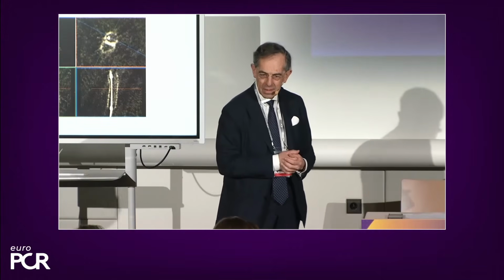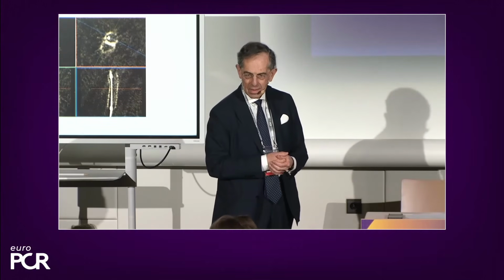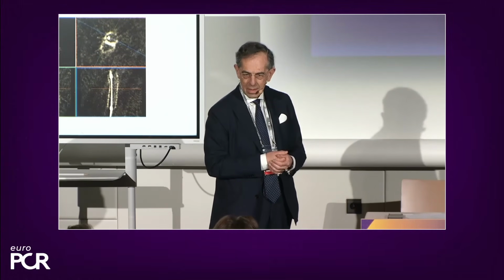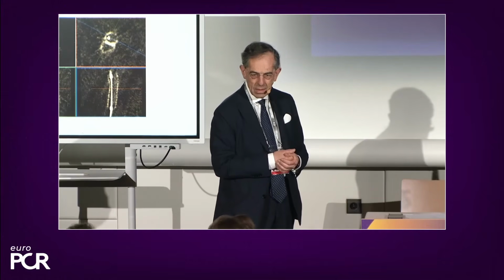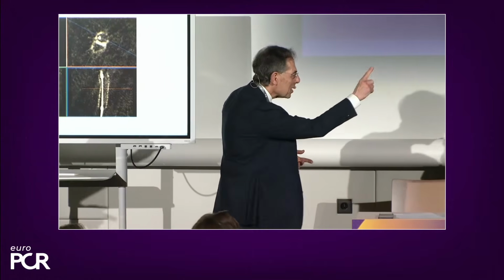And then a very last one, it's not strictly related to the technology, but still we are here to learn, so why not? Let's say that I detect a very elliptical expansion of the stent, but the area is good. Should I do anything, or do I leave it? Okay, very quickly to everybody. Carlos. I think when you have elliptical expansion, you should try to improve your MSA, but we need to acknowledge that even after the use of intravascular imaging in severely calcified vessels, expansion is not round and we don't get these beautiful results, and that is the way it is.